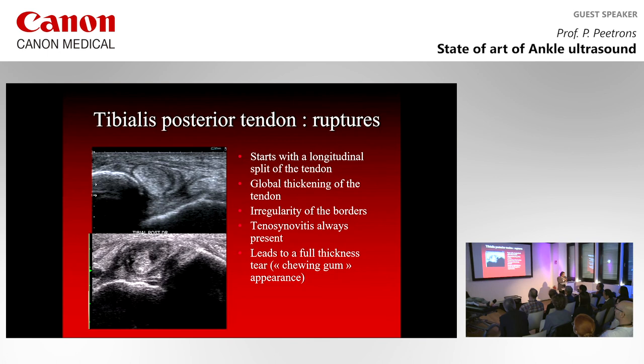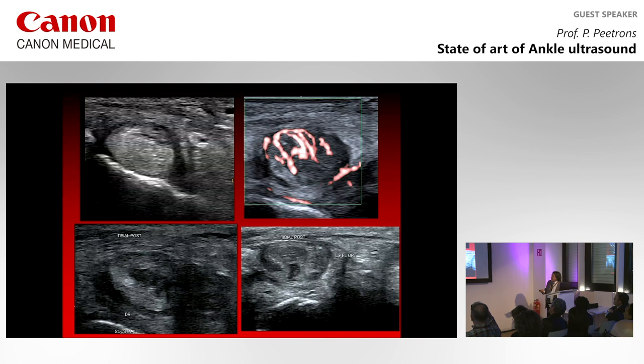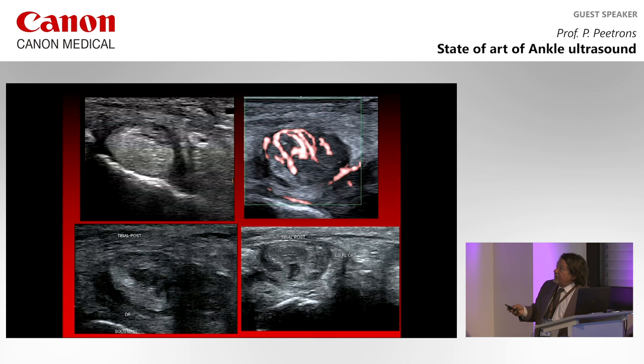I will end with these images that we can now see with tendon lesions. You can see very clearly little clefts and little holes inside the tendon. This is all tibialis posterior. And with the microvascular imaging, you can see hypervascular imaging of the tendon, which is clearly abnormal.